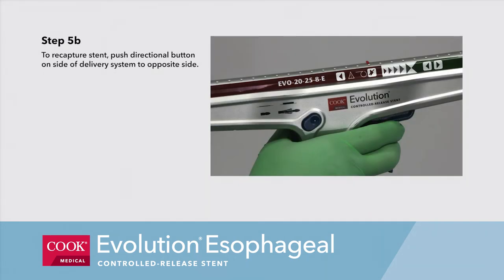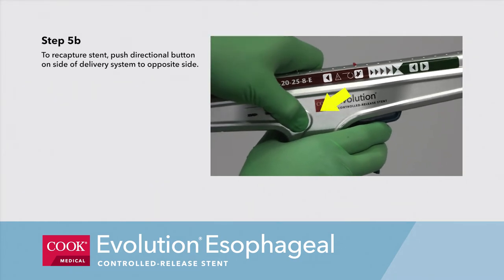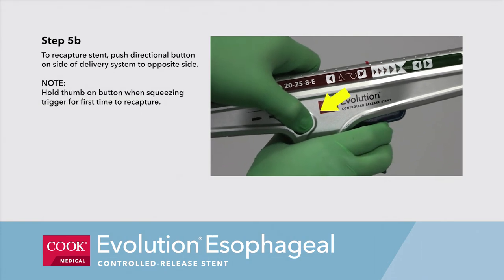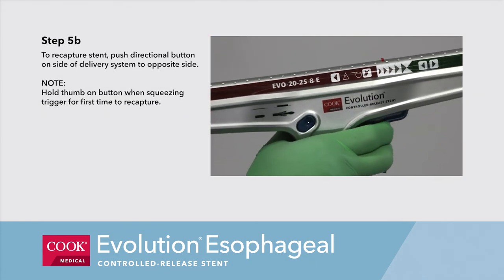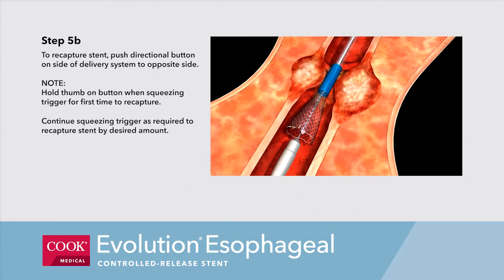Step 5b. To recapture the stent, push the directional button on the side of the delivery system to the opposite side. Note, hold your thumb on the button when squeezing the trigger for the first time to recapture. Continue squeezing the trigger as required to recapture the stent by the desired amount.